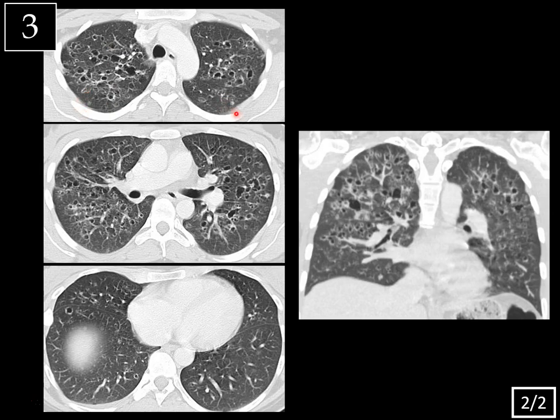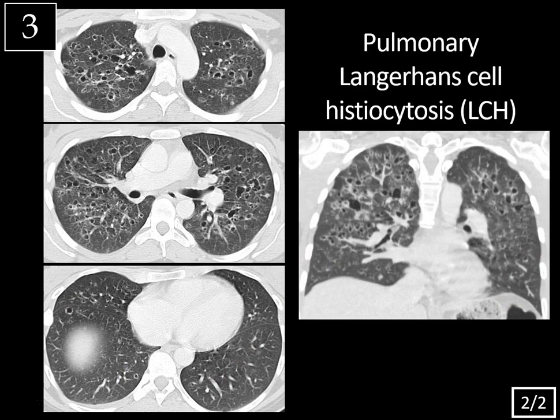We also see a few faint ground glass nodules scattered throughout the lungs — it's a combination of cysts and nodules, not just cysts. A key point is that the lung bases are relatively spared; notice how the costophrenic angles have no involvement. In a 30-year-old smoker, this is typical for pulmonary Langerhans cell histiocytosis. This type of LCH occurs in young adult smokers, typically 20 to 40 years of age. The distribution — with the lung bases relatively spared — is key.